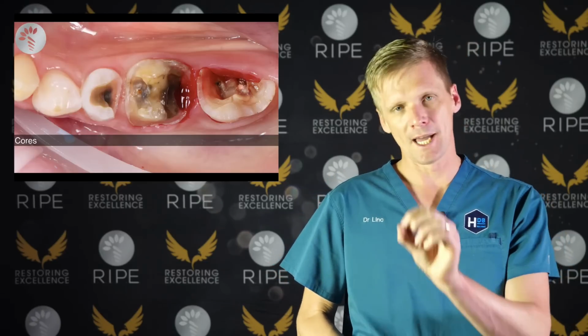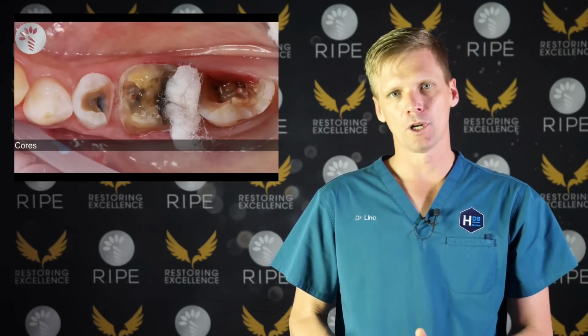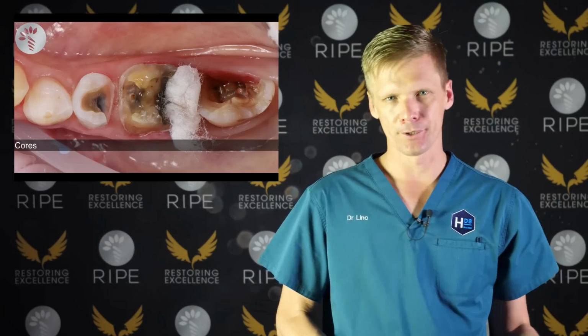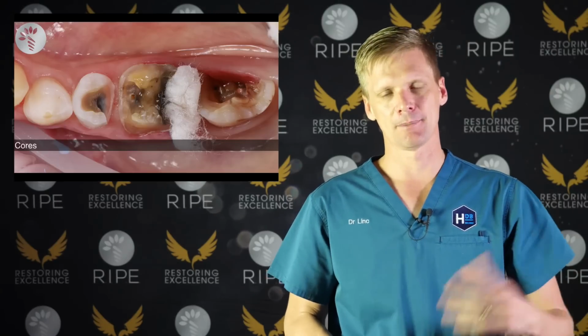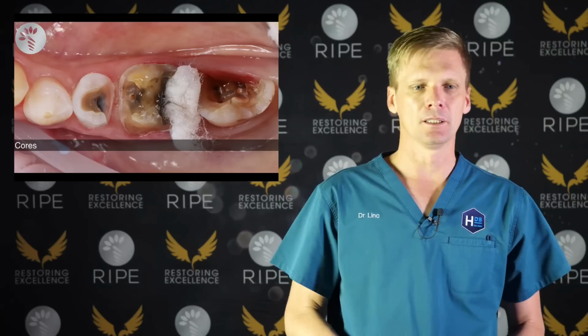So first of all, you can't see it all in this particular picture, but there is thick retraction cord on the distal of that tooth, and now I've got cotton that's soaked in Viscostat Clear, and I packed it in there, and then I went and did a consultation in the next room. So my hygienist, Caitlin, had a patient, and he was asking me about implants, so I went and did a consultation on implants. By the time I come back, the tissue is like this.